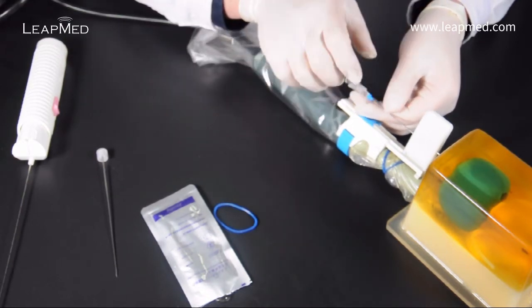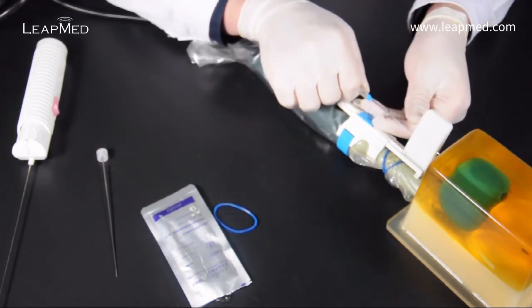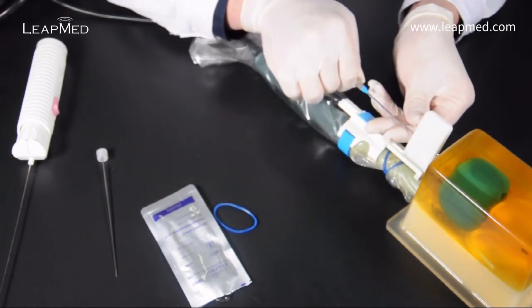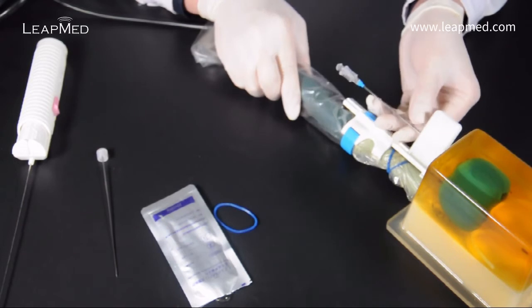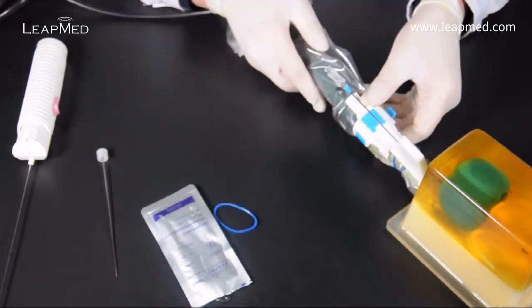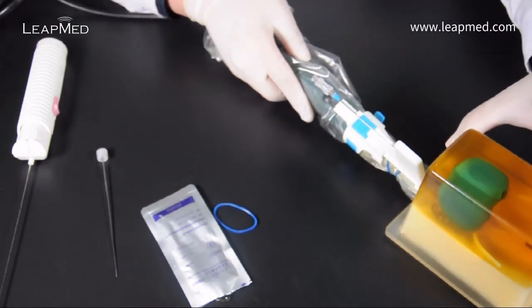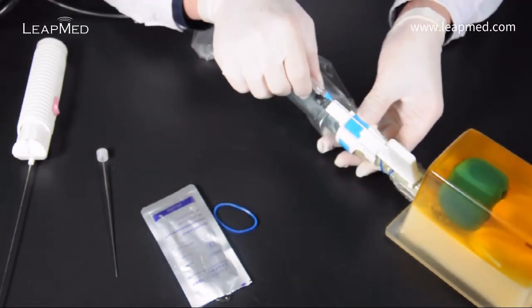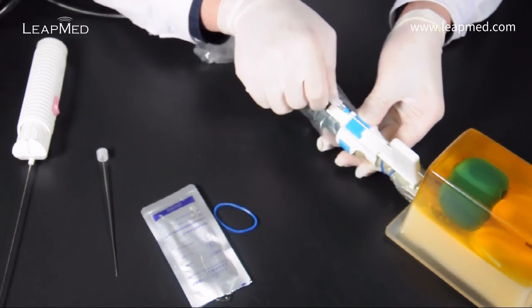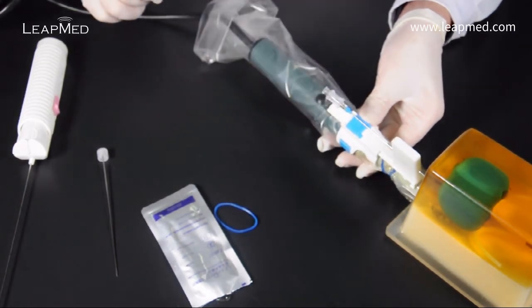During transperineal prostate biopsy it is not uncommon to take several biopsies from the same puncture hole. You can rotate the probe to choose another needle path for the introducer. You can use the biopsy needle to continue and take another 5 or 6 biopsies from here.